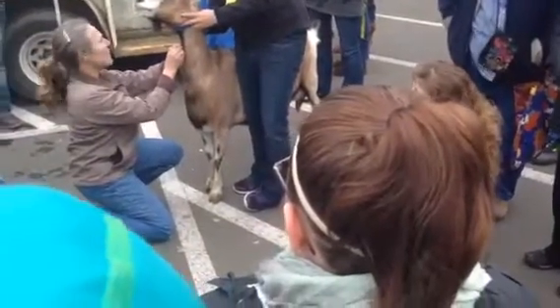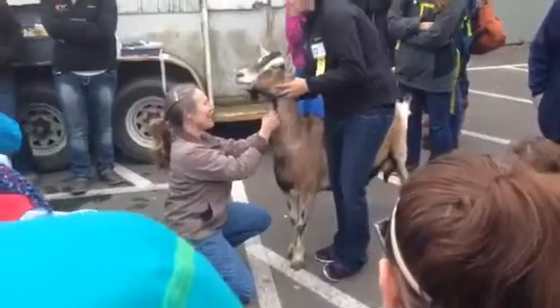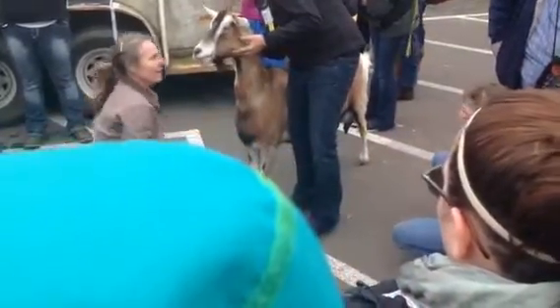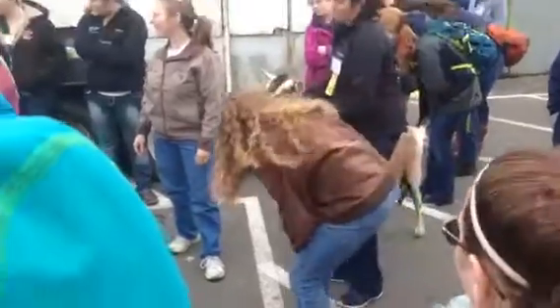She has sutures. I don't have sutures. I'm going through the tape, under the catheter, and through the tape on the other side. Florida! See you on lunge. Bye-bye.